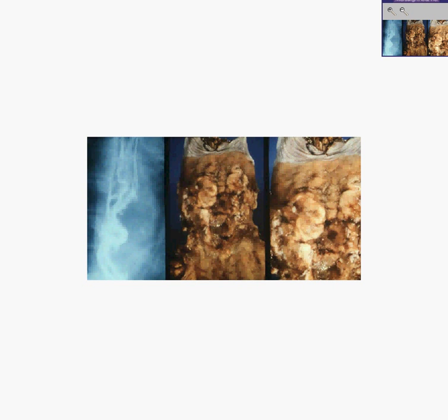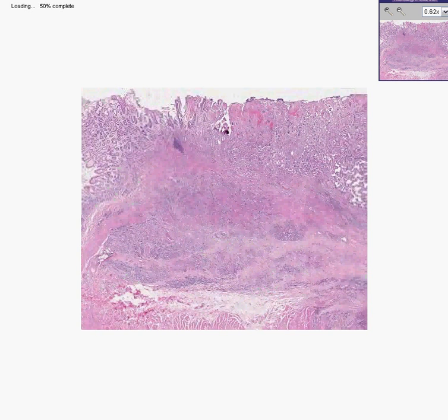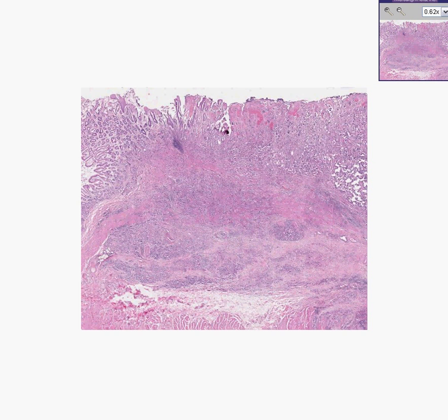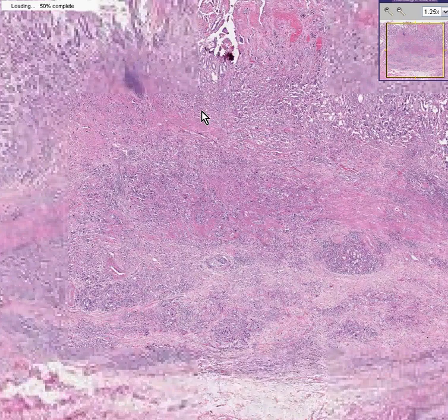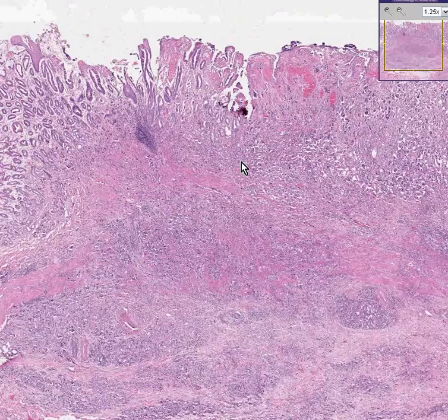If the esophagus were 100% squamous all the time with no ectopic glandular mucosa from Barrett's reflux, or if there were no submucosal glands, then theoretically all of the carcinomas of the esophagus would be squamous cell carcinomas — and actually most of them are. But many are adenocarcinomas because sometimes you have gastric-type epithelium within the esophagus, which is glandular, and with enough time and enough other carcinogenic factors, this can turn into cancer.